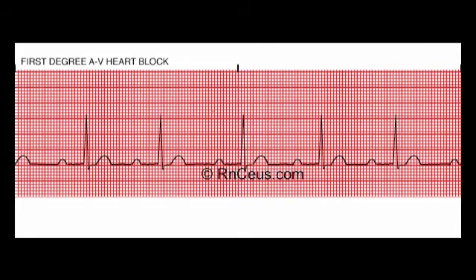Here is a blown-up picture of the first degree AV block. This looks like an otherwise normal sinus rhythm — we have a nice R-to-R interval, a nice P-to-P interval, an upright rounded T-wave, and our QRS complex is within normal duration. The one abnormality is the PR interval, which normally should be between 0.12 and 0.20 seconds. Here it is very prolonged throughout the entire EKG with no fluctuation. If my PR interval is greater than 0.20 seconds throughout the EKG, I can call that a first degree heart block. Diagnose it as a sinus rhythm with a first degree AV block.